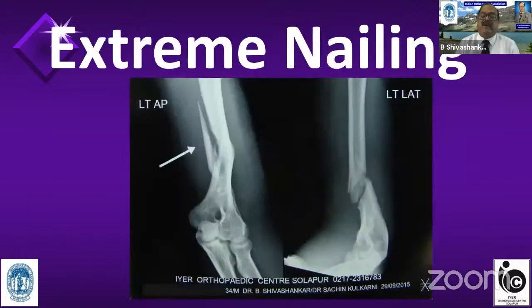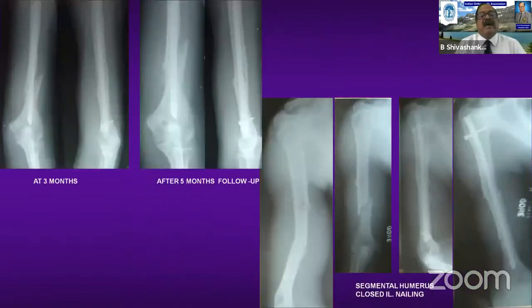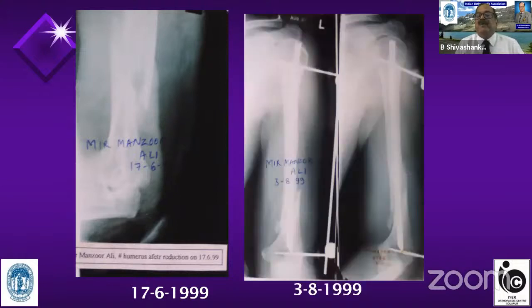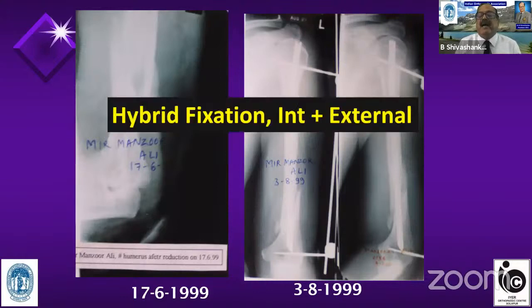Lastly, extreme nailing, because I know my friend Sergio is going to show some cases, a very distal fracture like this. So I also do extreme nailing in the very distal third. As long as 1 inch of space is available, I'm comfortable. If 1 inch of space is not available, only a few centimeters are available and I'm not happy, what am I going to do? This is a hybrid fixation I do. I don't advocate this as a general treatment. In the last 20 years, I might have done fewer than 10 cases only, because with an external fixator along with an internal fixator, there is a high chance of pin track infection. So you have to take this not as a standard treatment.